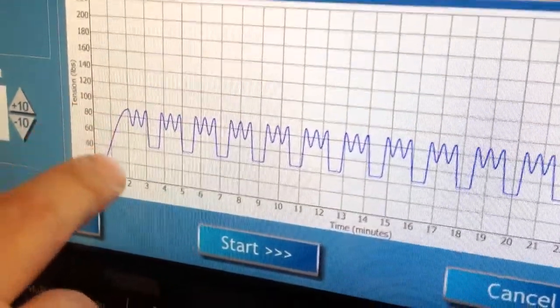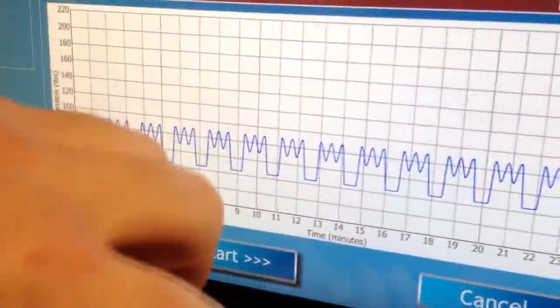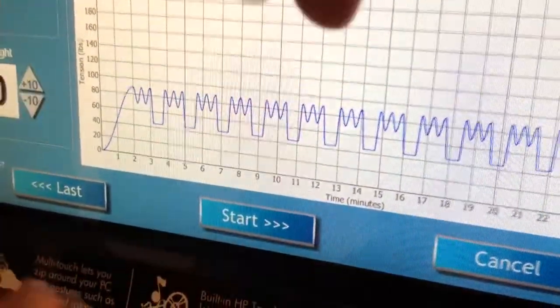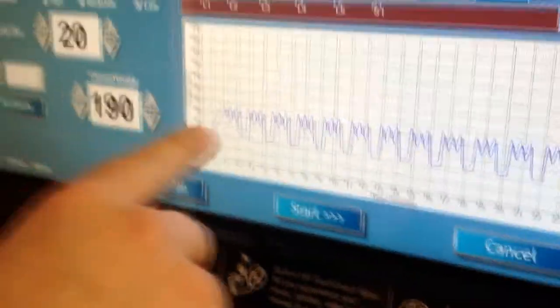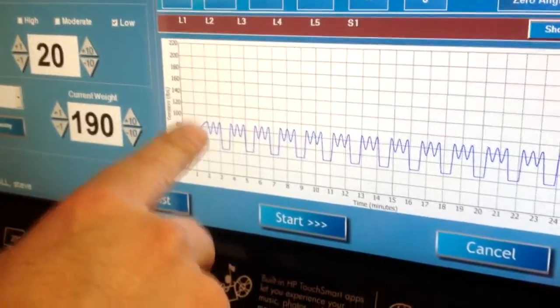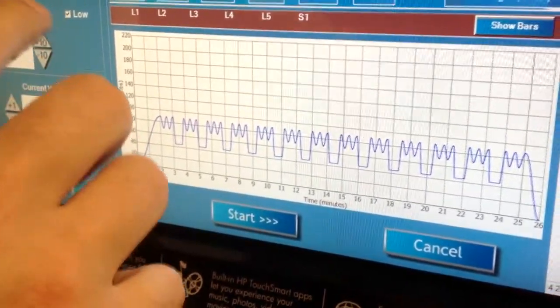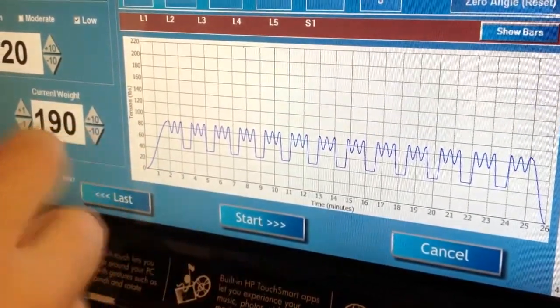So here we have two peaks. So the joint is sort of opened and then, that probably looks quite strange, but as you can see we have a 20 pound or roughly 10 kilo range of oscillation at the point that the joint is open.